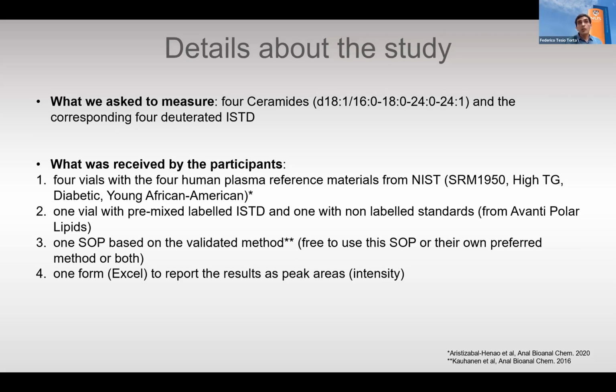The participants also received 1 vial with pre-mixed labeled internal standards, and 1 vial with non-labeled standards to build the calibration curve. And we then also sent an SOP based on a validated published method. So this SOP included a quite detailed step-by-step procedure for the ceramide extraction from plasma, for the preparation of the external calibration curves, and for the use of the MRM-based LC-MS/MS method.